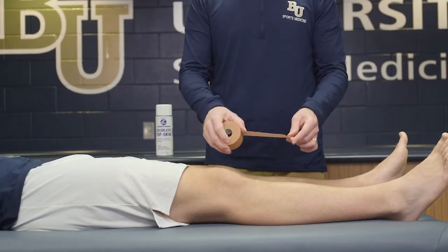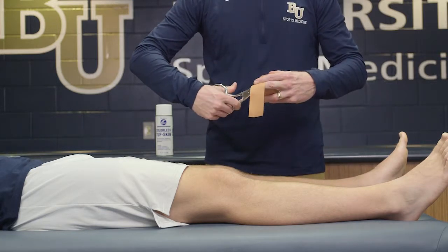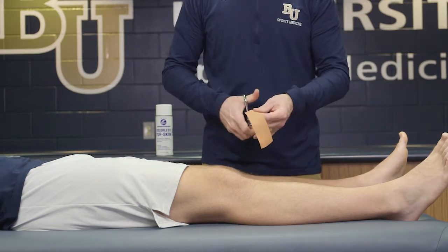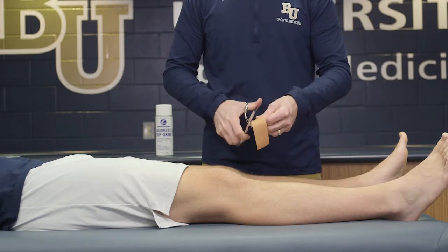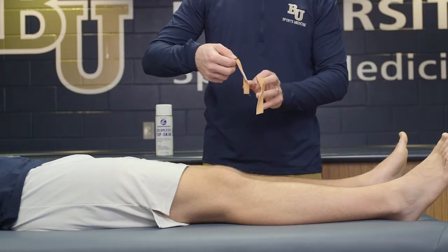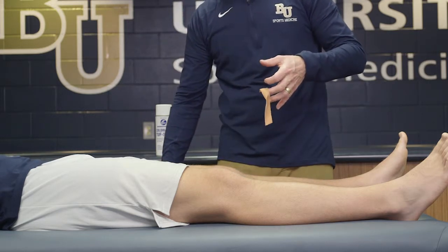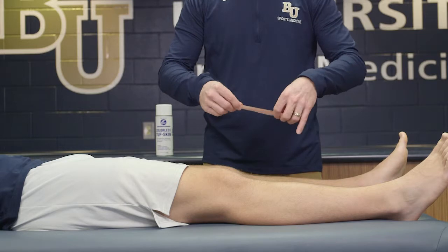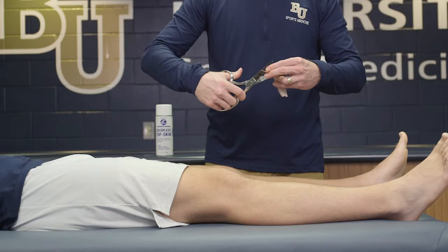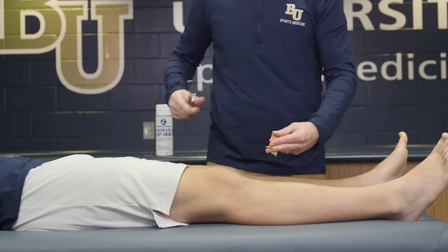We don't really need a lot of equipment here — we only need a small slice, just a piece of tape about this length. We're going to cut it in half to give ourselves two little half strips of tape. I'll place one just off to the side and use that in just a little bit. I do need one a little bit longer than the other, so I'm going to cut off probably about an inch to an inch and a half off one piece so it's a little bit shorter.